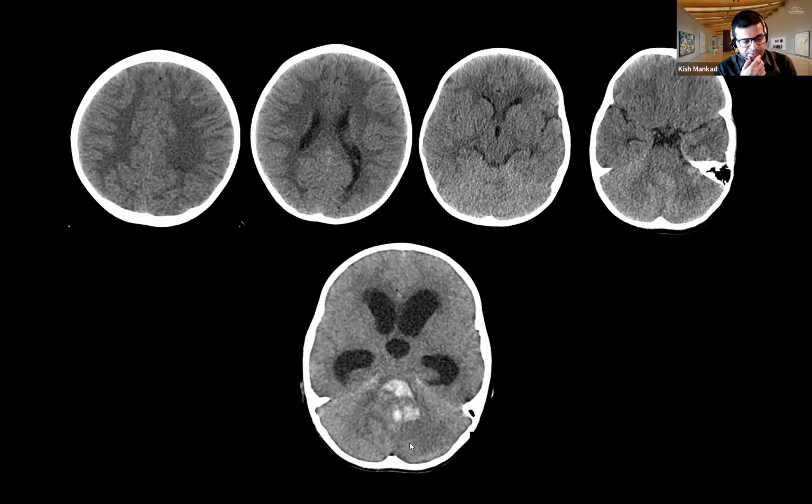And I can tell you that this eventually turned out to be a medulloblastoma that had bled. And the child did not do too well. Unfortunately, I guess we could have totally resected the tumor at that particular point in time, and the outcomes would have been better. The moment you have hydrocephalus step in with a tumor presentation, the outcomes cognitively, even if by survival are better, cognitively, they are not.